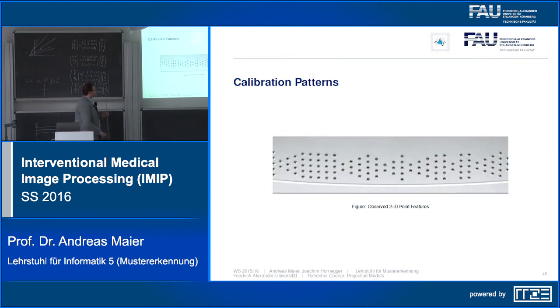So this is the feature point pattern that is encoded here, and you have a stop bit sequence. So you have to detect, this is the stop bit sequence. So this sequence here and this sequence here appears again, and in between you have encoded the position along this full circle. Yeah, so you have to detect those triangular shapes, and in between those, you have always four lines of beads that actually encode an ID. And if you detect two of those triangles and this code in between, you can figure out this code. And if you have decoded this code here, then for every bead that you have detected, you will have the perfect world coordinates.